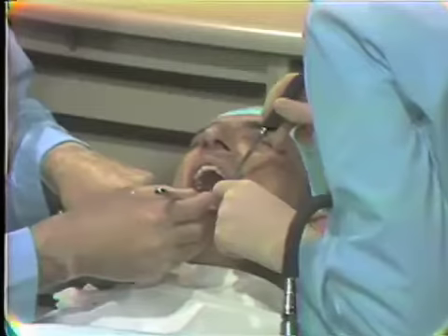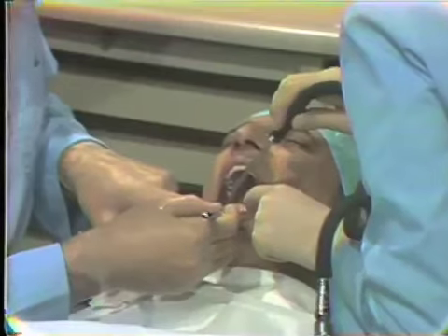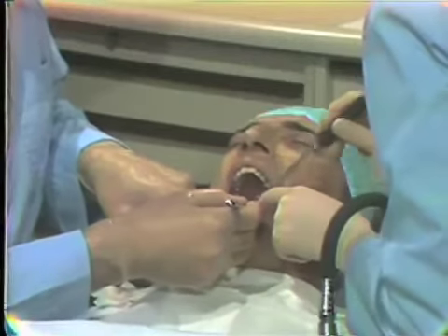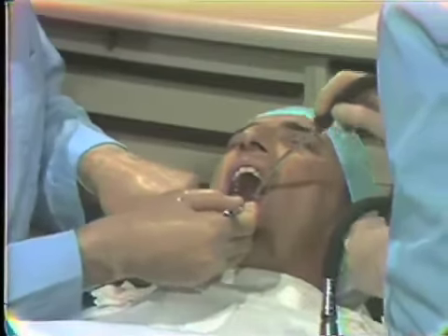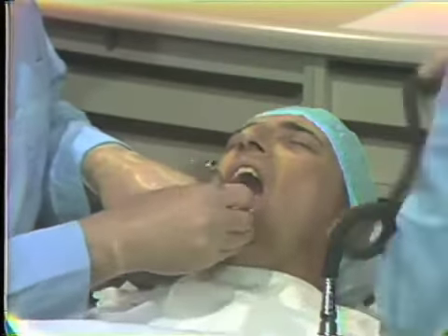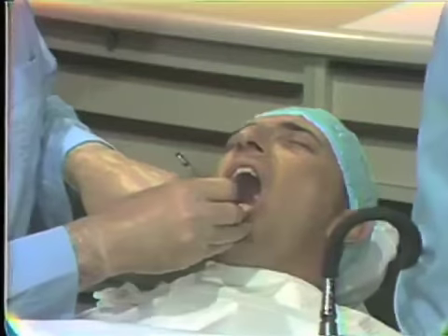Having completed then our scaling and debridement in the interproximal areas, and having made certain that the root surfaces are clean and free from calculus and smooth, we are to the point then where we can begin to check our flap for the placement of sutures.